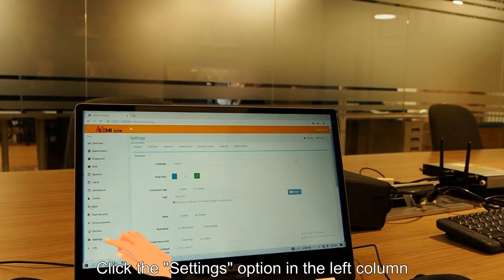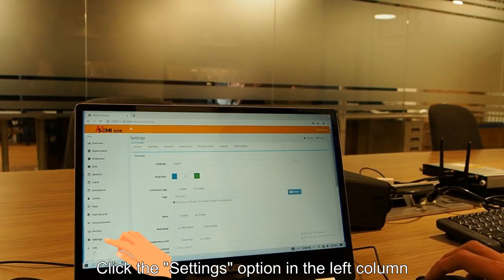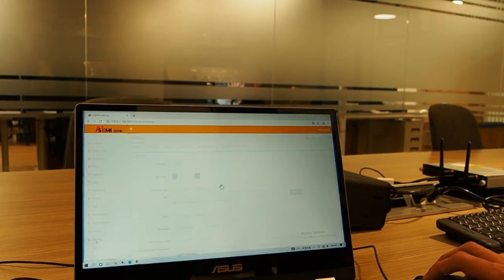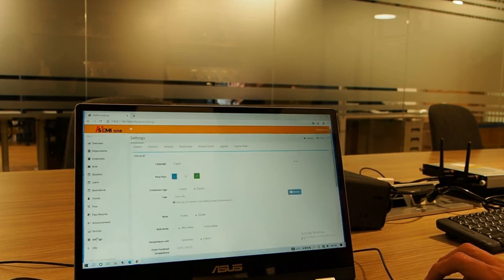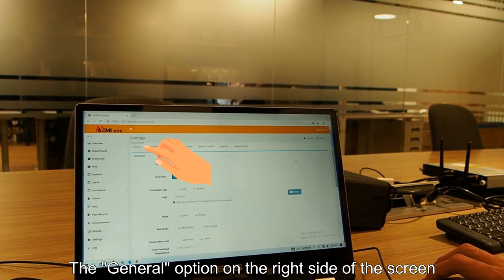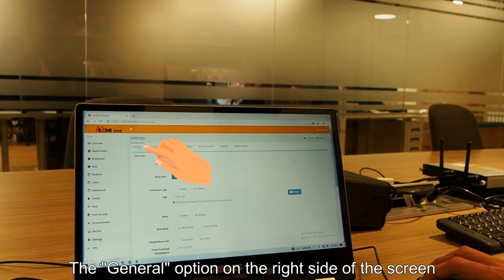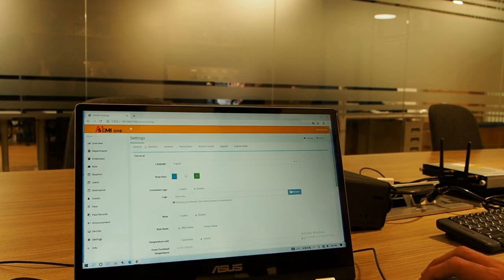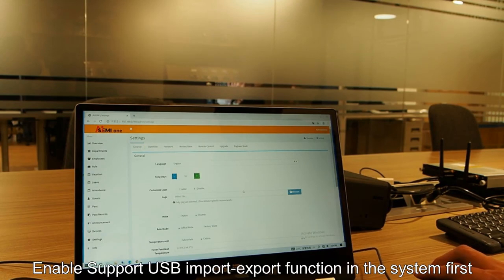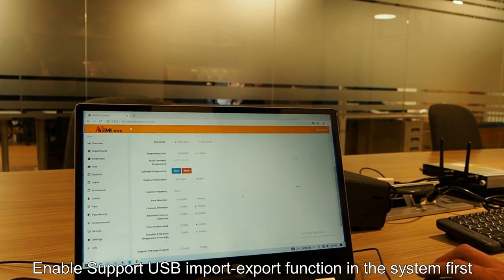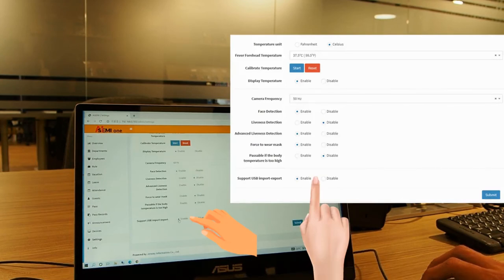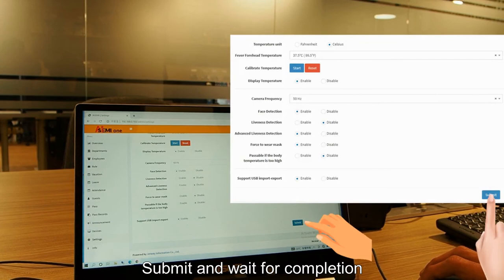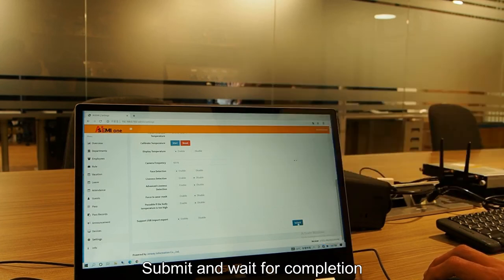Click the settings option in the left column, then the general option on the right side of the screen. Enable support USB import and export function in the system first. Submit and wait for completion.